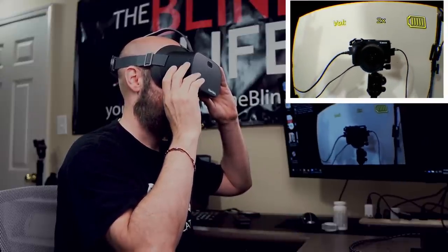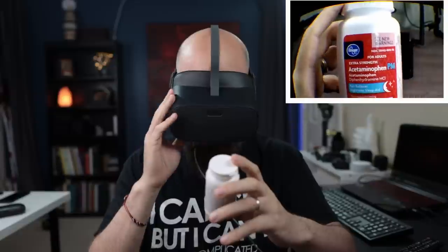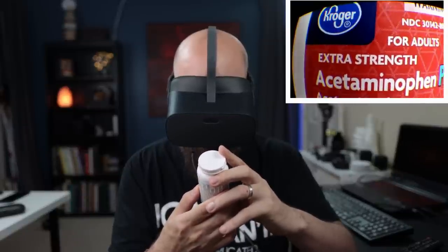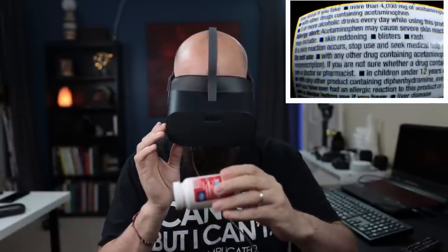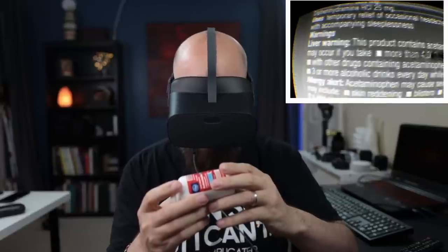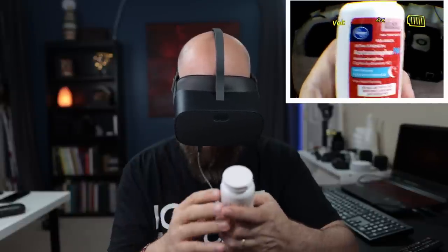I can zoom out and also invert to reading mode. Let's try to read something — I've got a pill bottle, some over-the-counter medication. Zooming in, we can see 'acetaminophen.' It's a pretty clear image, the colors look good. Inverting reading mode gives us some highlighting, though this bottle is round so there's a bit of a challenge. But overall it works pretty well — it's your standard digital video magnifier.